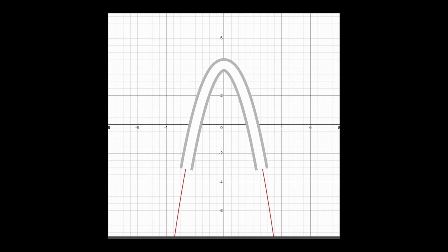And so if we take this model that we made, right? I took that ellipse and turned it upside down, right? And so imagine we're looking at the left ventricle part of maybe an apical four-chamber view, right? So this is the parabolic structure of that left ventricle, right? If we oversimplify it, put it here, and then we superimpose that on a graph, right? Remember this from way back when in high school geometry and trigonometry, right? You have your X and your Y axis. So we're going to superimpose this parabolic structure onto a graph.